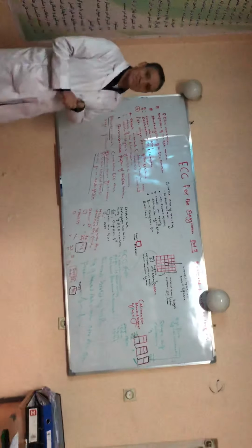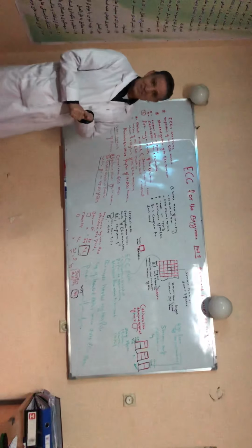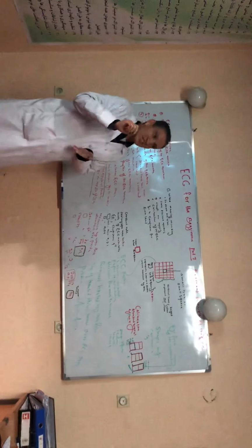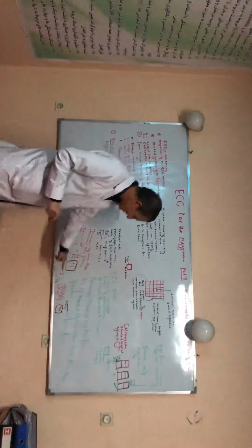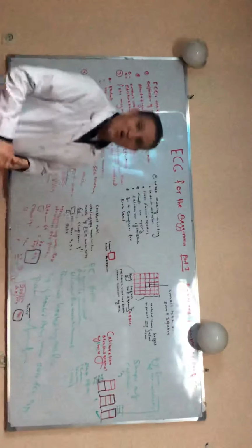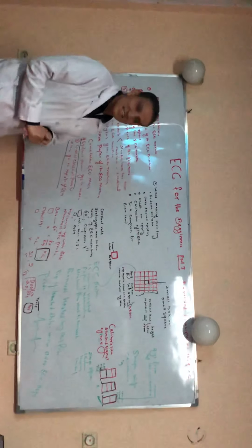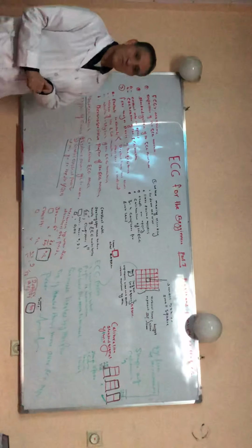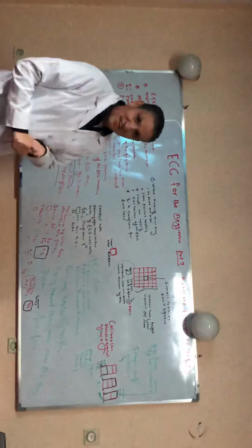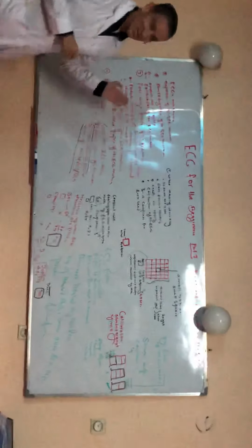What is the ECG machine? The ECG machine is a standard electromedical instrument which records the electrical activity of the heart by drawing a trace over a moving paper. This moving paper is called ECG paper. ECG paper is a standard graphic paper which is made from large squares as well as small squares. Later on I will have a detailed discussion about the ECG paper.